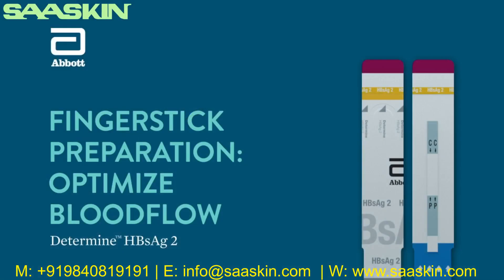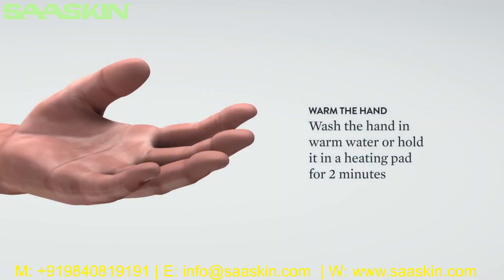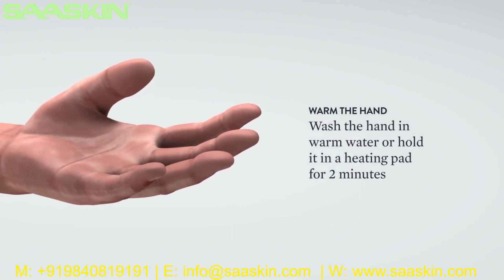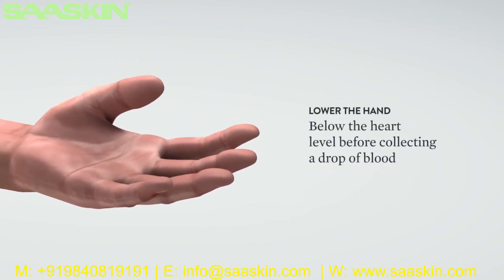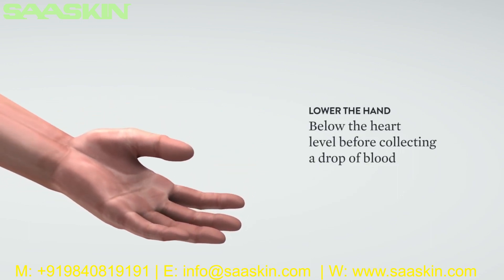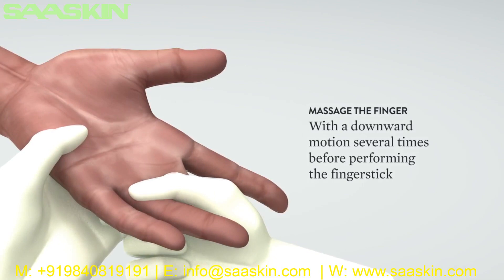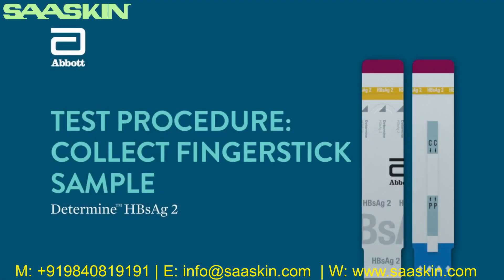Finger stick preparation: Optimize blood flow prior to collection. Warm the hand by washing it in warm water or holding it on a heating pad or hand warmer for a couple of minutes. Lower the hand below the heart level before collecting a drop of blood. Massage the finger with a downward motion several times before performing the finger stick.